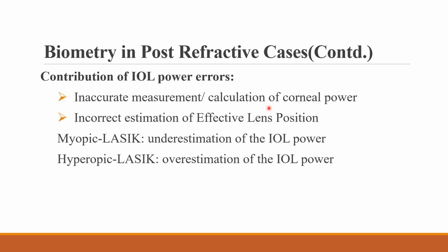Biometry in post-refractive cases, contribution of IOL power errors: inaccurate measurement or calculation of corneal power, incorrect estimation of effective lens position, myopic LASIK classically underestimation of the IOL power, and hyperopic LASIK overestimation of the IOL power.